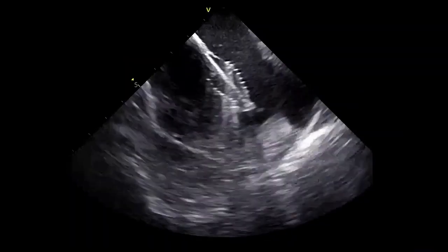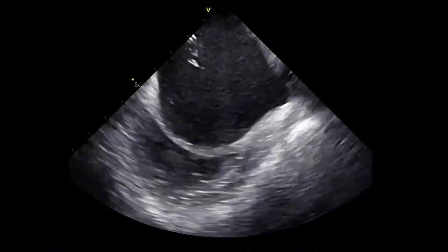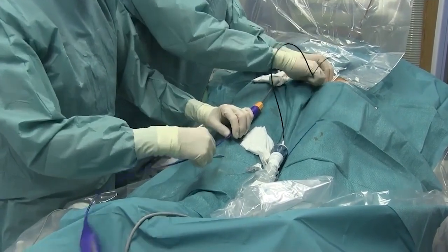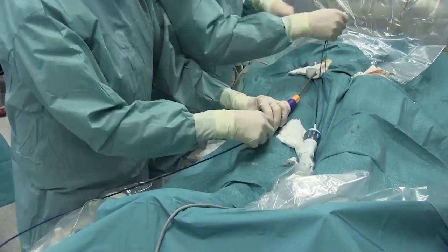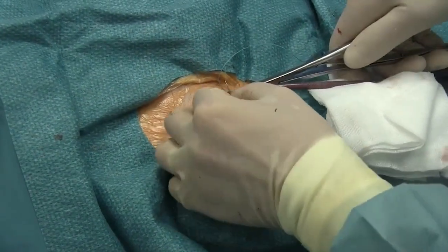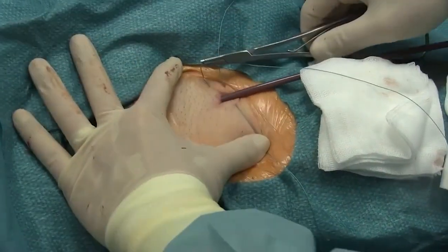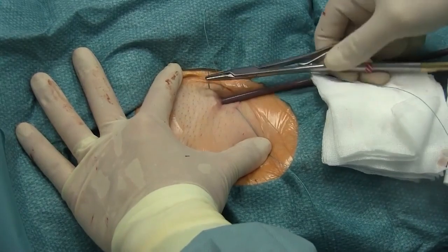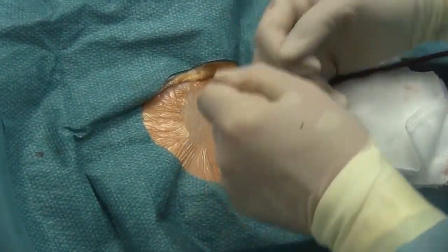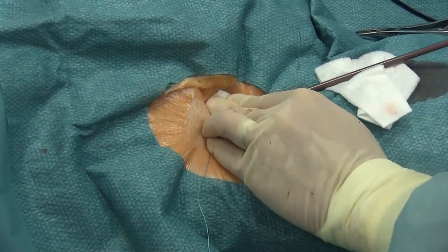Then all catheters are retracted. The cannulation site is closed by a figure of 8 suture to achieve venous hemostasis. After tightening of the suture, no bleeding is observed despite full anticoagulation with heparin.